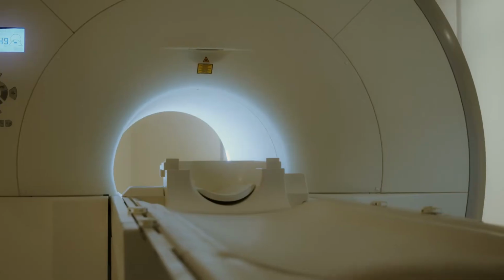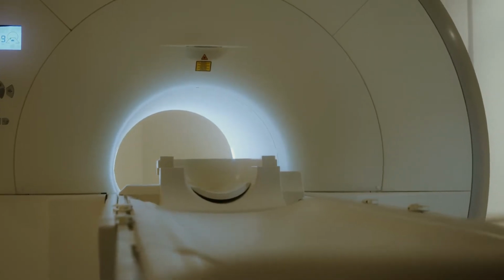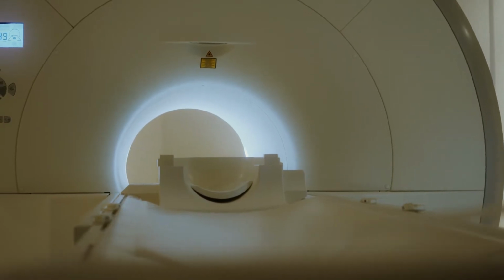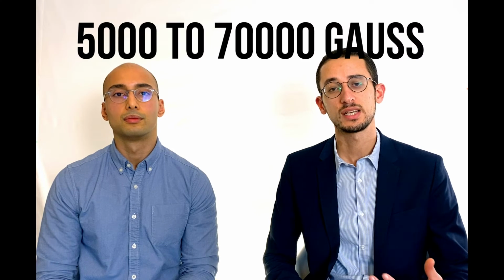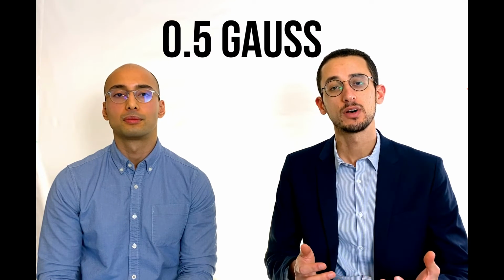The magnets inside the MRI scan are very strong. This is measured in what's called Tesla. The power of the MRI scan magnet can be as low as 0.5 and as high as 7 Tesla, which is equivalent to 5,000 to 70,000 Gauss. You can imagine how strong this magnet is, given the Earth's magnetic field is about 0.5 Gauss.